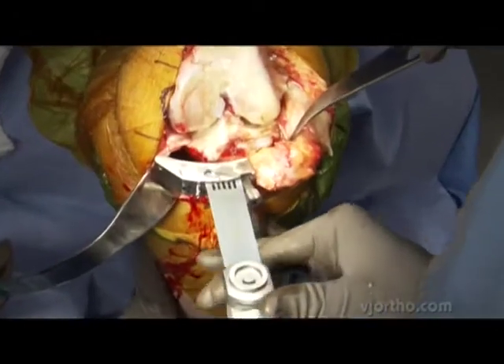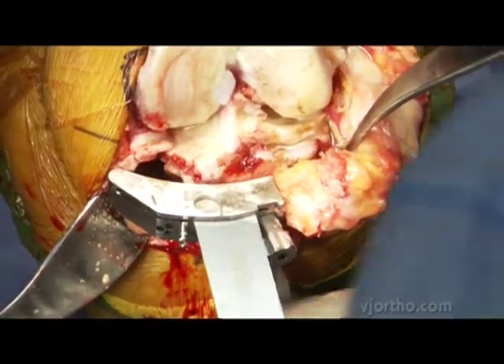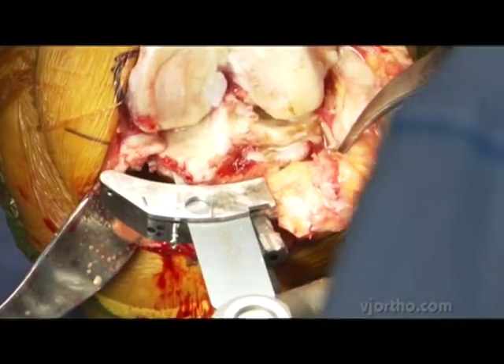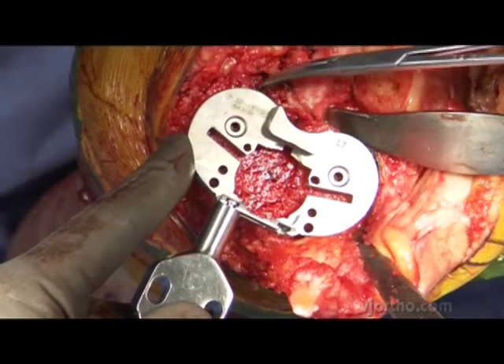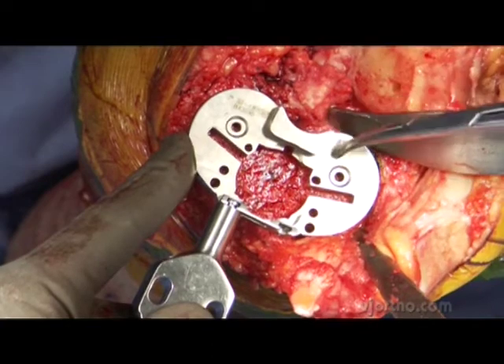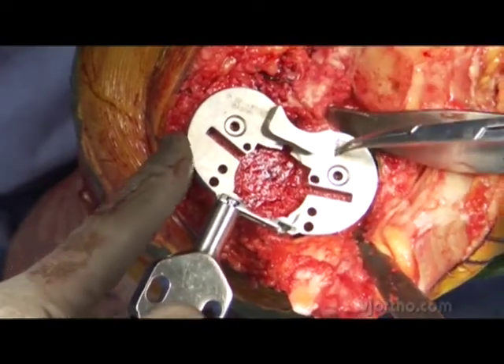We'll go ahead now and do our proximal tibial cut. You can see we're retracting the medial collateral ligament to protect it. Here's our 67 tibial template — I have good coverage laterally, good anterior cortical contact, some exposed posteromedial bone indicating that my rotation is right. I like the size, and we're going to go ahead and pin this in place.